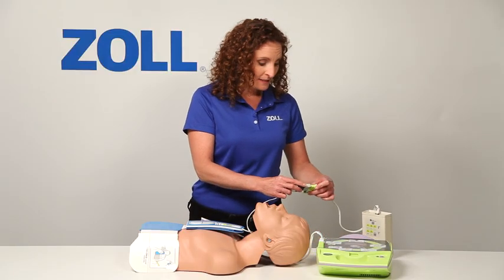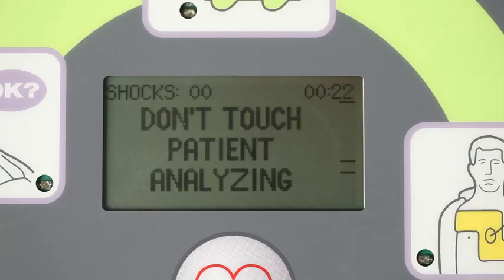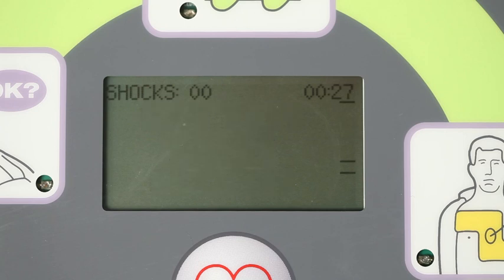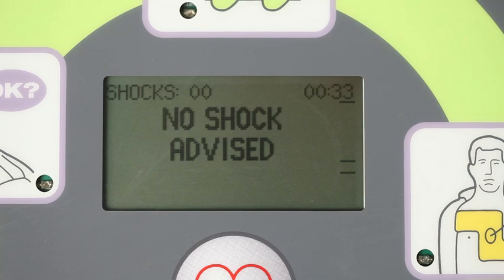When I plug it in, the AED Plus recognizes the presence of a heart rhythm and begins analyzing it. Don't touch patient. Analyzing. No shock advised. Start CPR.